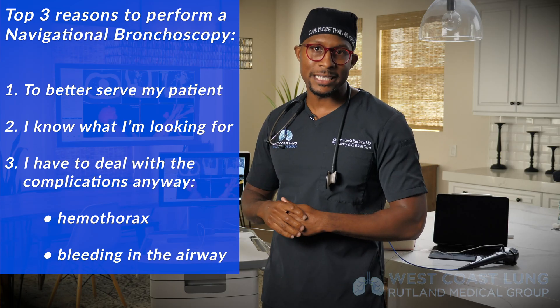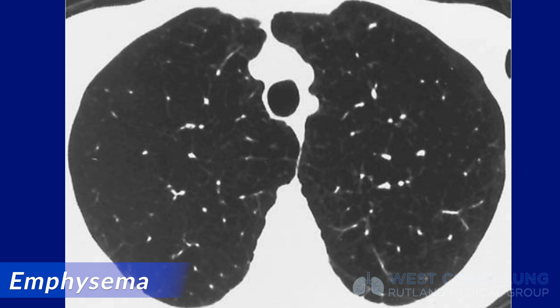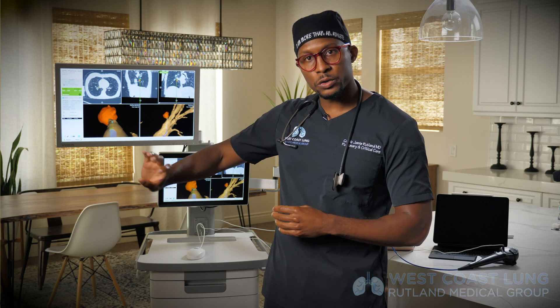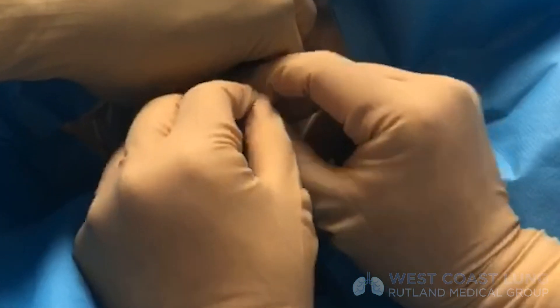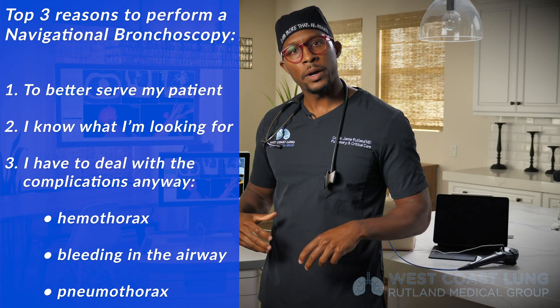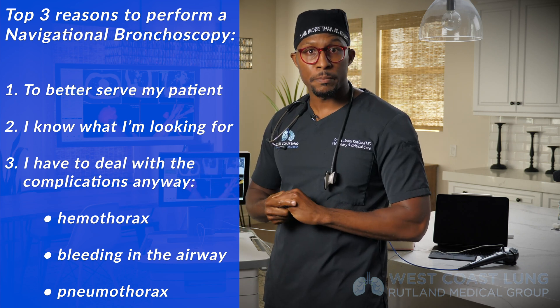The third complication that can take place is called a pneumothorax. Occasionally patients will have significant amounts of dead lung on their CAT scan — dead lung is also called emphysema. If you poke a hole in that dead lung, you can get a rush of air into the pleural space and the lung will collapse. If it collapses, you've got to put a tube in and suck the air out. The person who does that procedure is also me. So reason number three for why I do navigational bronchoscopies with biopsies is because I have to take care of the complications anyway — I might as well know about them sooner.